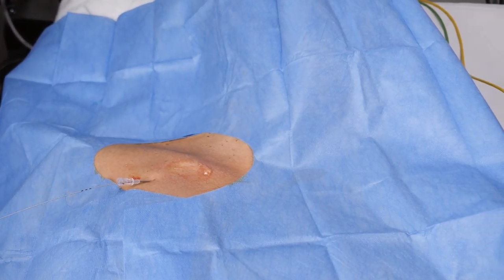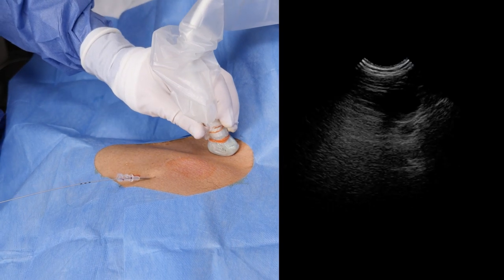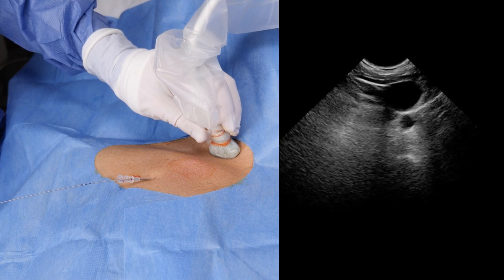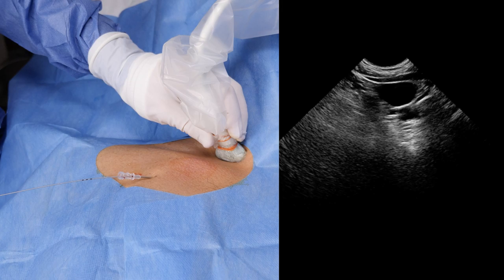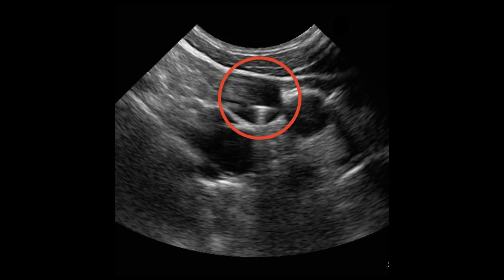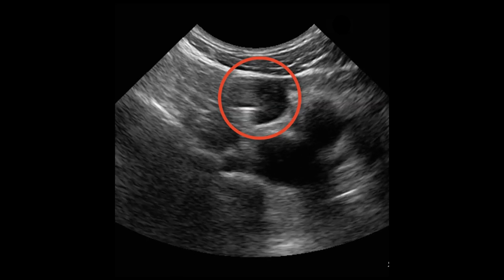Move the probe to the neck and increase the depth to about 10 centimeters. Place the probe perpendicular to the internal jugular vein. If the guide wire has deviated cranially, this will appear as a hyperechoic dot in the vessel. This is clearly visible in an example from another patient, where we were able to promptly reposition the guide wire.